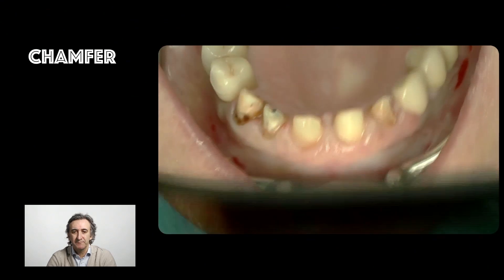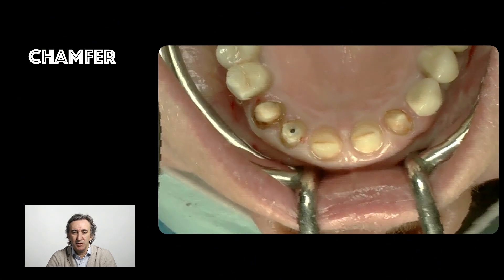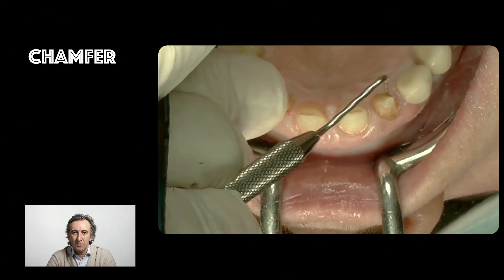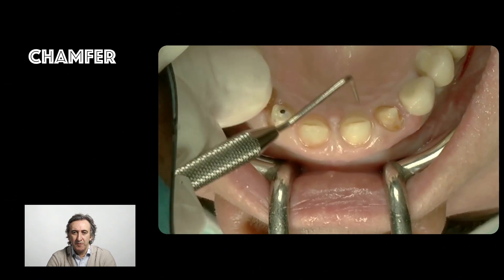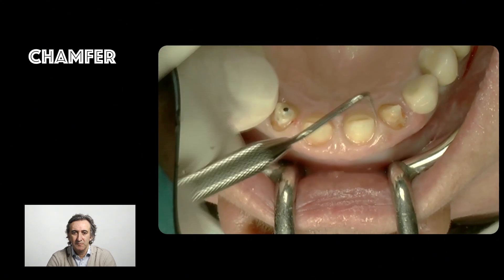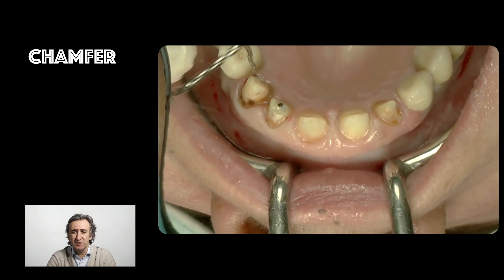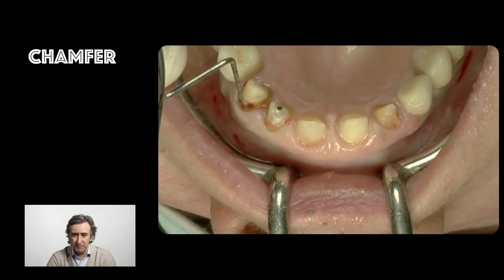At this point, as you can see from an occlusal view, the tooth preparation all around will give us enough clearance for the restorative material.